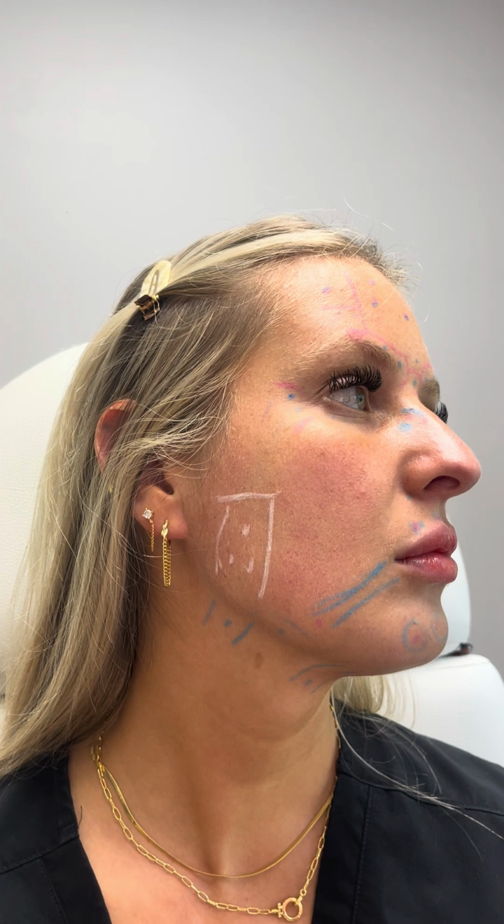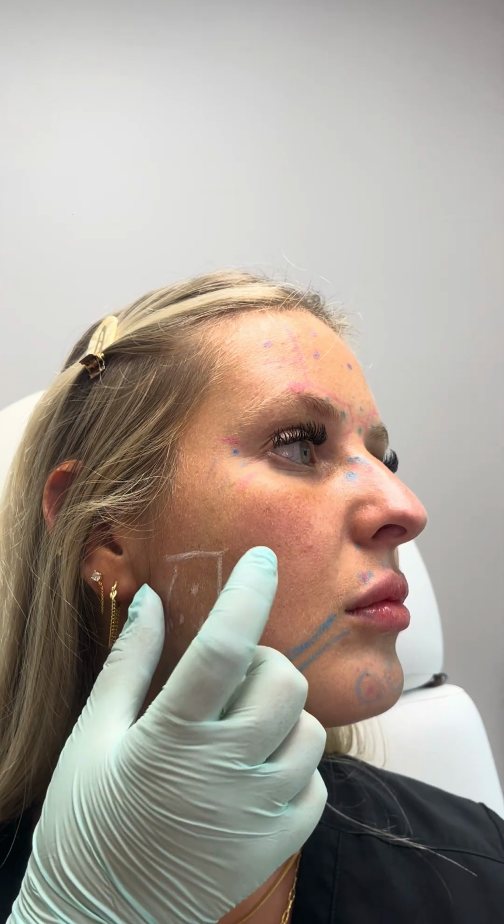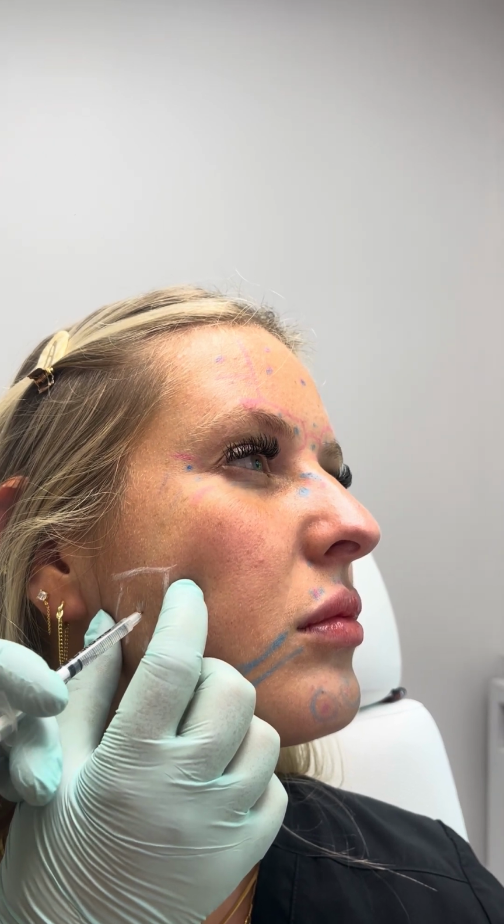I already cleaned her off, so I'm just going to do 4 units in each injection spot. And what I find is actually when the patient clenches and I inject them, that doesn't pinch as much. So go ahead and clench. 1, 2, 3.